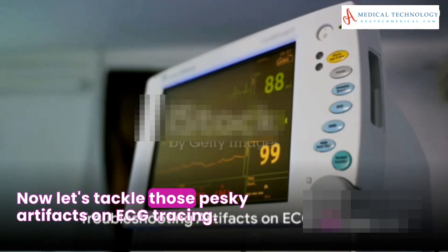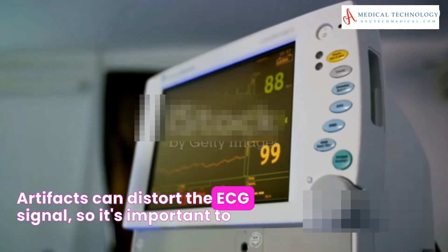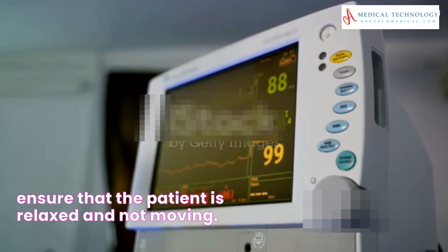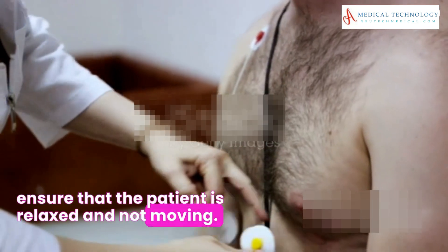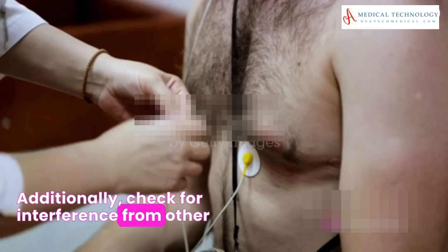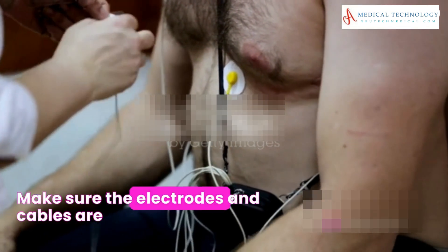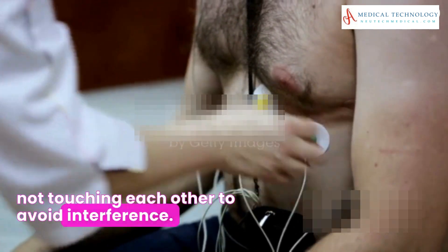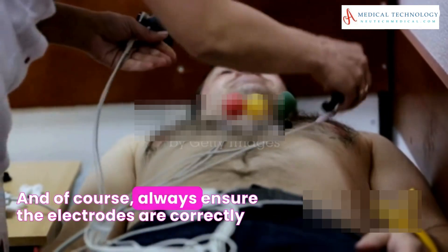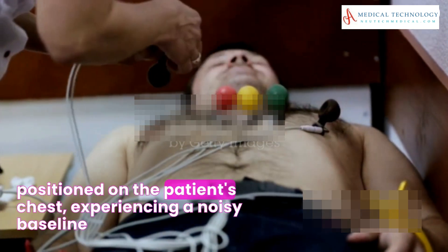Now let's tackle those pesky artifacts on ECG tracing. Artifacts can distort the ECG signal, so it's important to ensure that the patient is relaxed and not moving. Additionally, check for interference from other electronic devices in the vicinity. Make sure the electrodes and cables are not touching each other to avoid interference, and always ensure the electrodes are correctly positioned on the patient's chest.